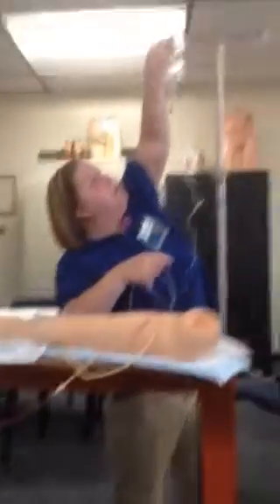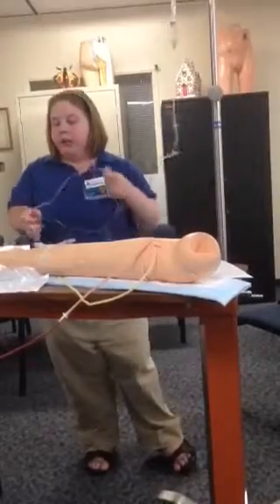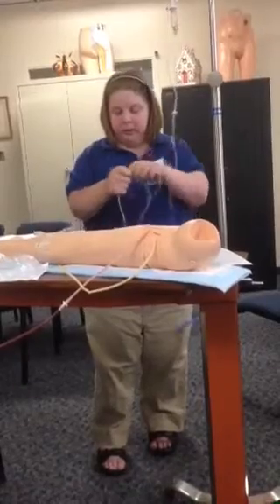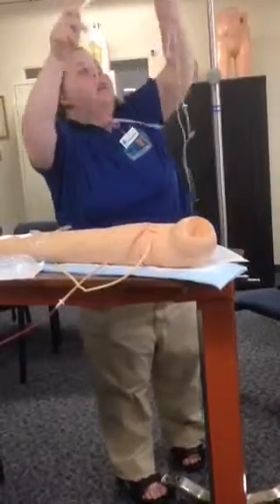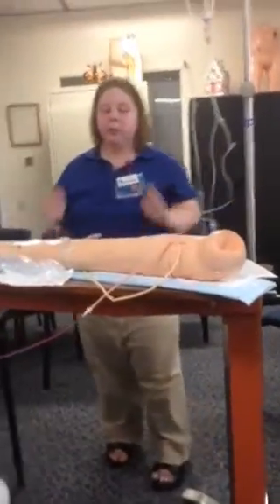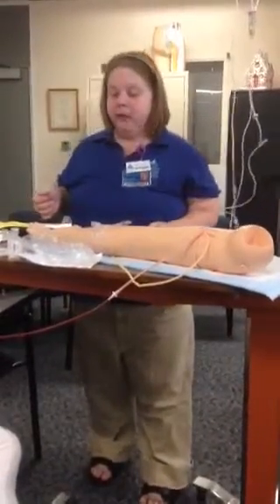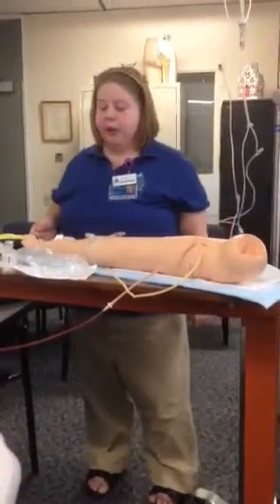and as I'm checking my doctor's orders, I would have also checked any patient allergies and lab work. So now I'm going into my patient's room. I'm introducing myself, doing my hand hygiene, checking their name band. I'm asking for 2 identifiers. I'm going to check their sites, make sure there's no redness, any phlebitis or infiltration.